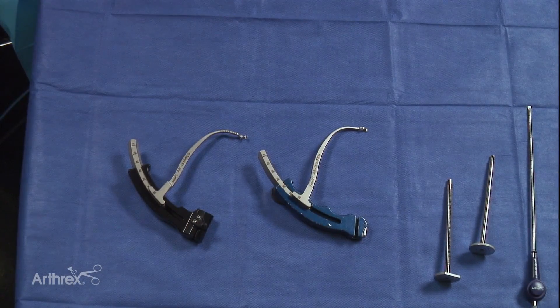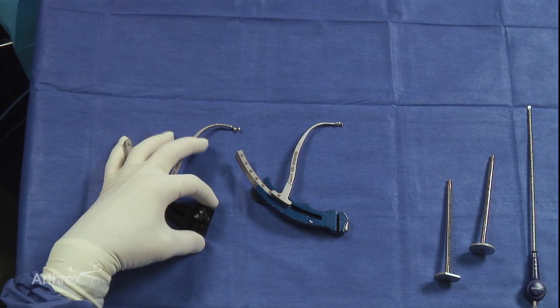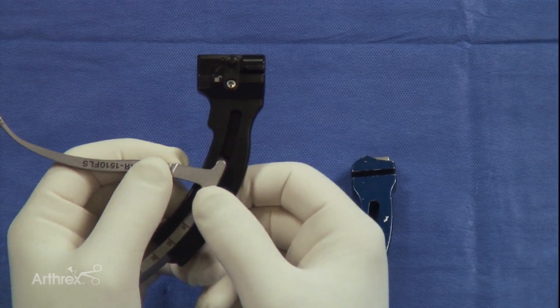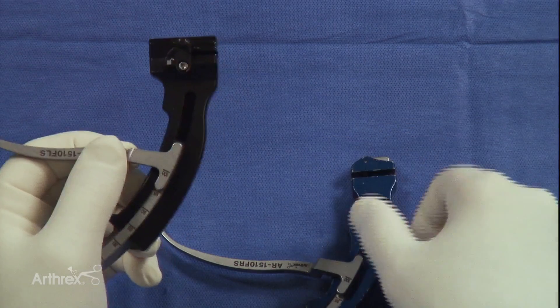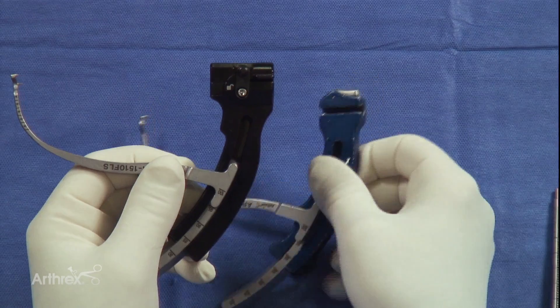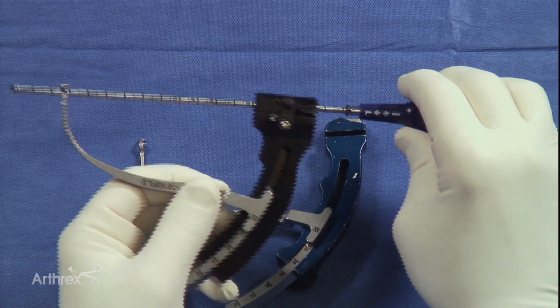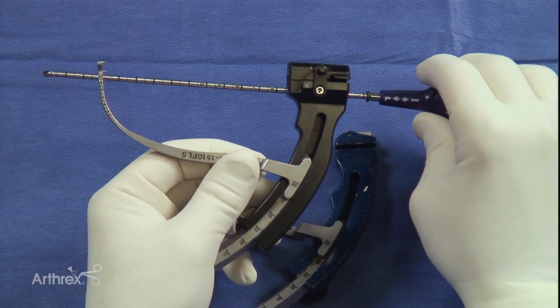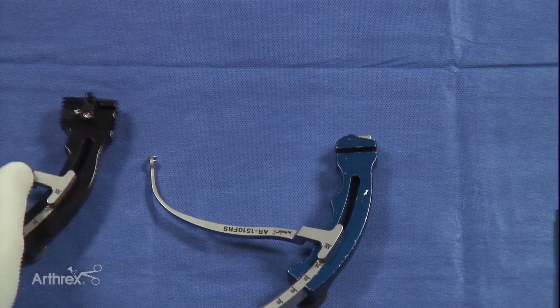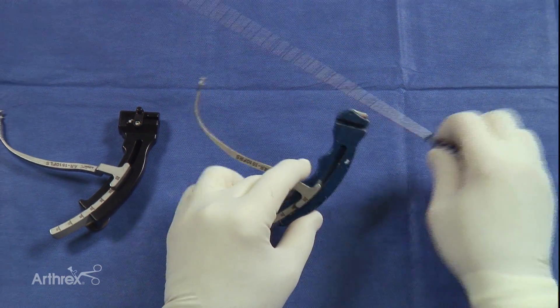An additional feature of the new guide, which wasn't present in the older guide, is the length of the housing on the guide. The advantage to this longer housing is stability — it's much less likely to toggle than the older version was. And obviously we have a shorter flip cutter, which also provides that advantage in that we're not dealing with a longer flip cutter where the potential to toggle was much greater with a shorter housing and a longer flip cutter.